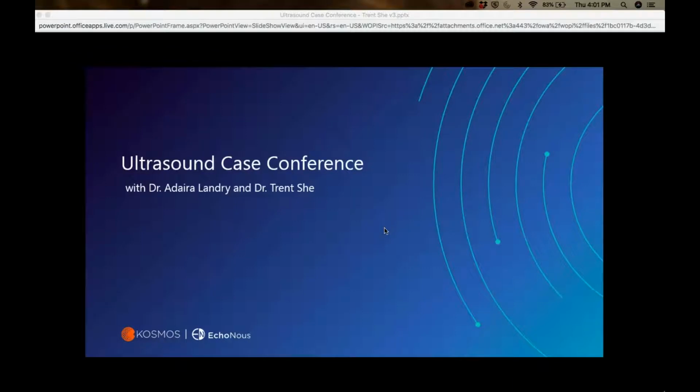Excited to have you. You are our inaugural guest to this ultrasound case series. And just to provide a little bit more context, as ultrasonographers, we do a lot of QA. We review a lot of images on our own, but we also review them together with our colleagues, and we discuss these images and how they are related to the patient care, and we review how to better optimize these images and sometimes bring in literature, and it's just a really nice discussion. And so we figure, why keep that just amongst ourselves? Why not bring in a greater audience? So that is the context for this series.